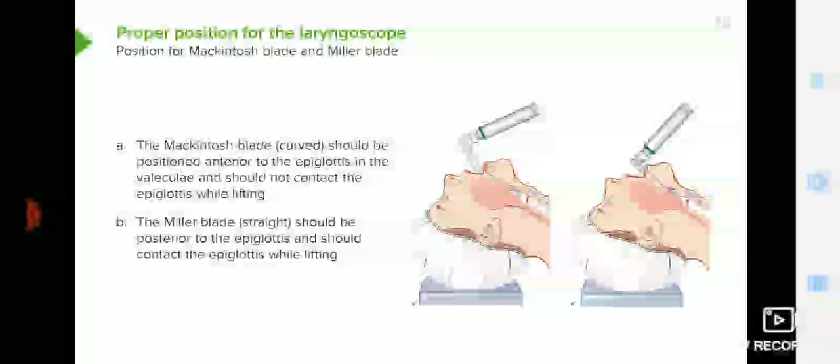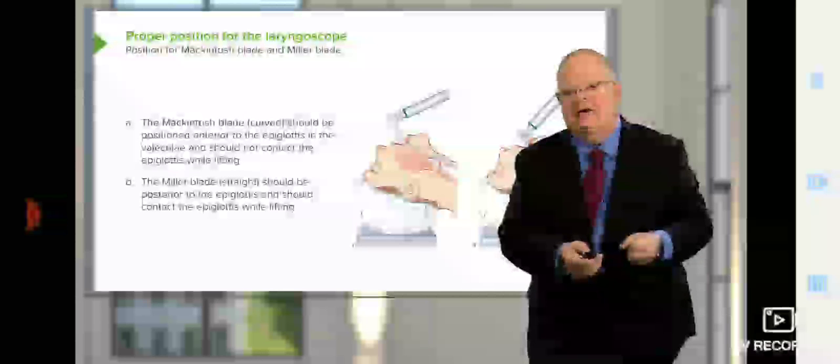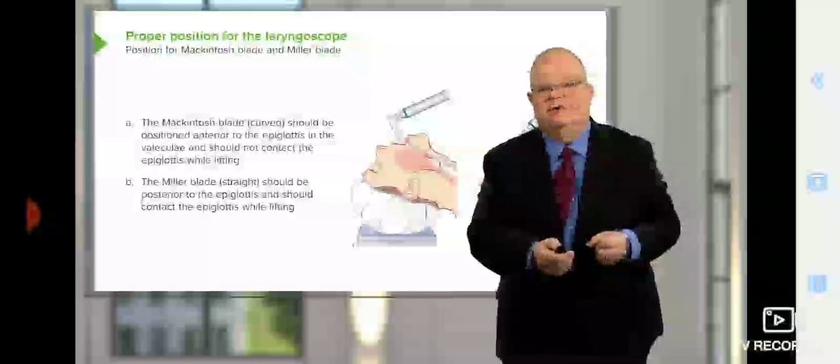It actually lifts the epiglottis, and there's some hemodynamic changes that can occur when you do that, particularly vagal stimulation, so you can get bradycardia and things that I'd just as soon avoid, so I don't use a straight blade.